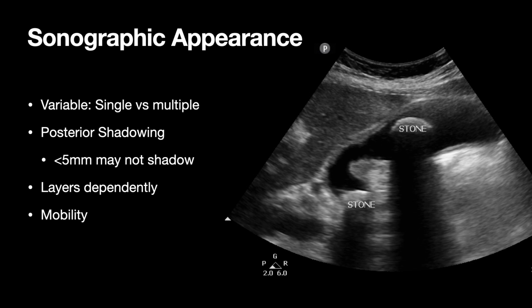There's a couple unique factors that these gallstones will exhibit that really help us identify that they're there and show what's going on. And that is, they're going to have a hyper reflective anterior surface, and they're going to have some shadowing, some deep, dark shadowing. What happens here is the sound hits the surface of the stone, interfaces with that stone, reflects back or is absorbed by that stone, and then we have a paucity of sound deep to that, causing that shadow. So all these big stones are going to show that.